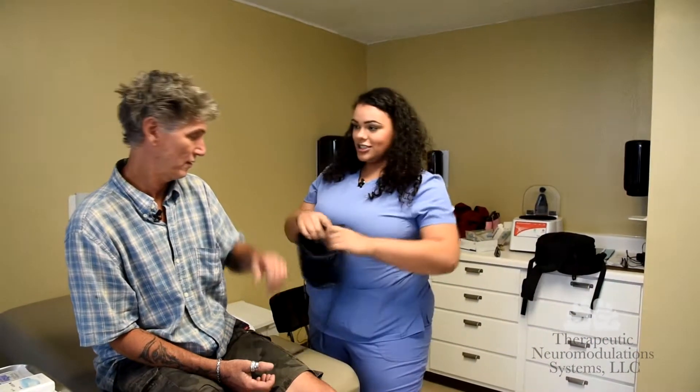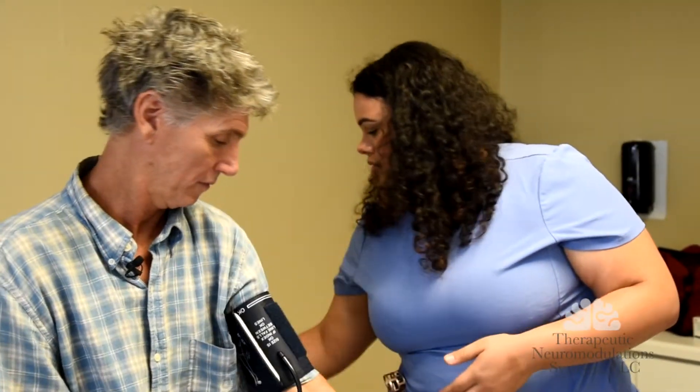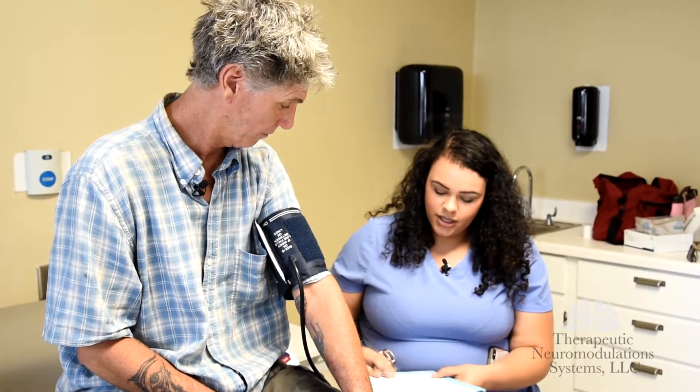I'm going to be asking you some questions while taking your vitals. Are you having stomach cramps, nausea, vomiting, or diarrhea? Yes, I am. Any sweating? Yes. Anxiety? Yes. Bone or joint aches? Yes. Goosebumps? Yes. Runny nose and tearing? Yes.